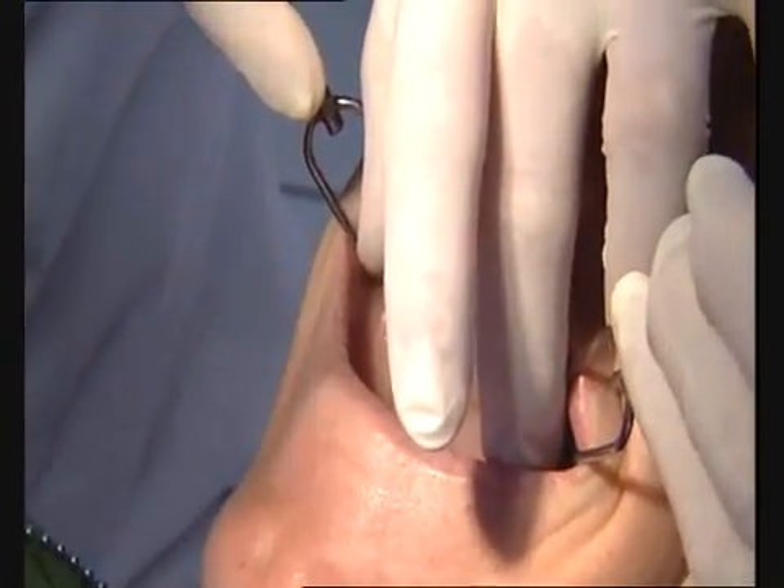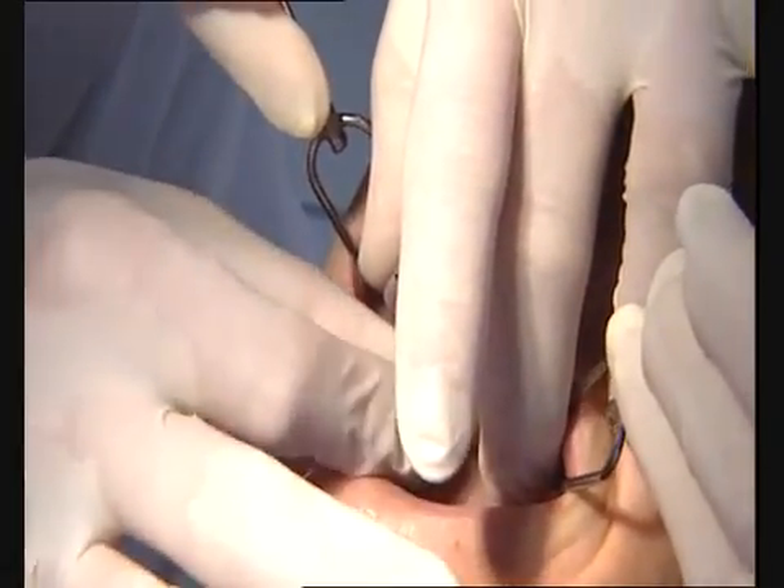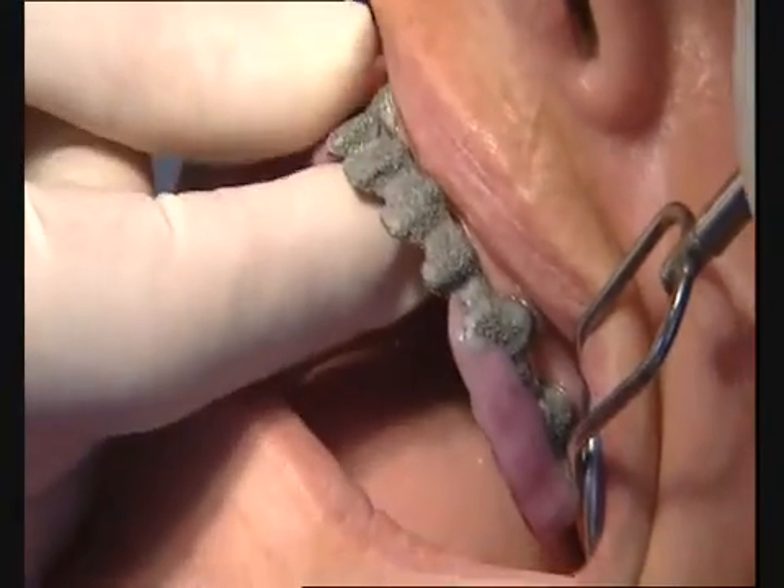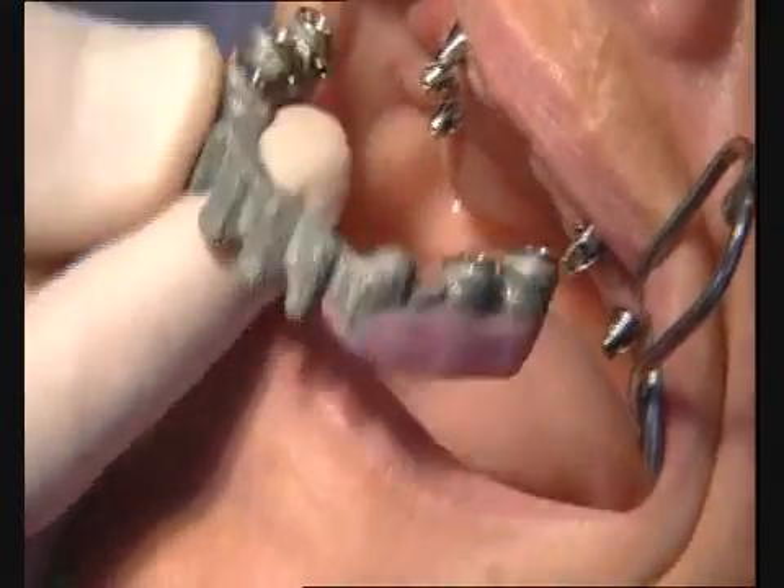The titanium copings ensure that the framework is fitted in the optimal position without pressure. This guarantees a completely passive fit of the framework structure on the implant.